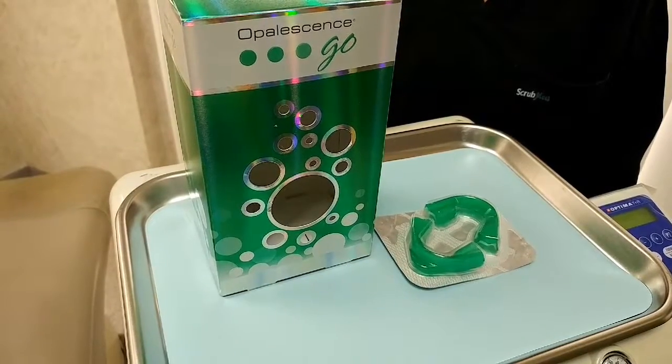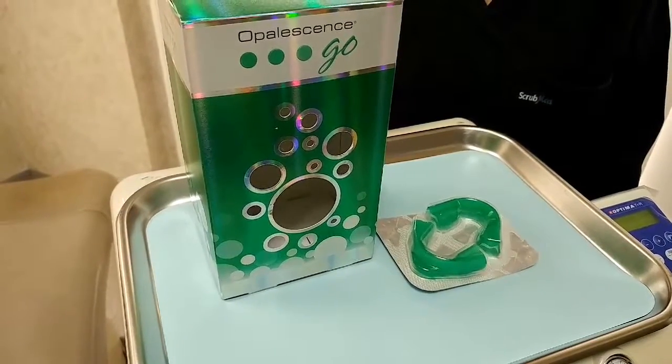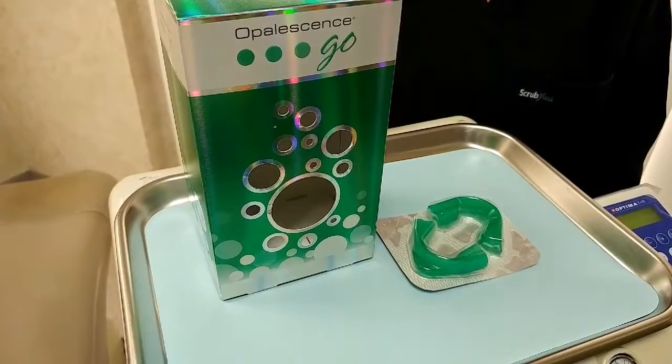We're always talking about the Opalescence Go at-home teeth whitening kit. Today we're going to show you just how easy it is to use at home.